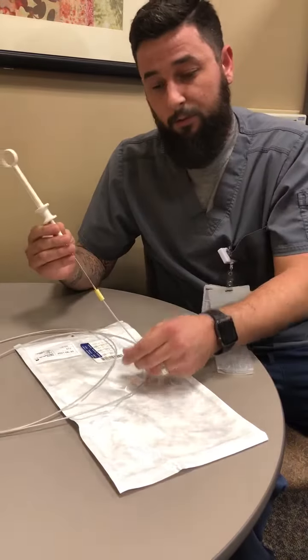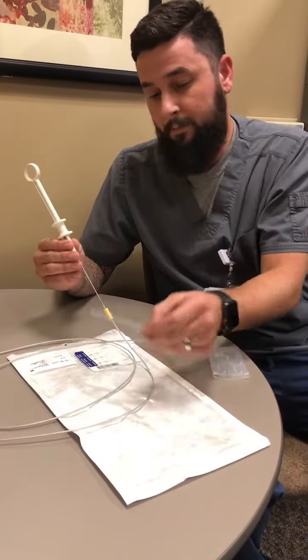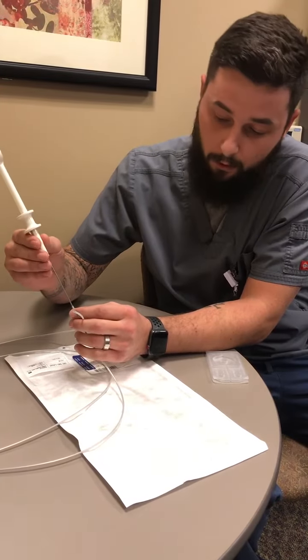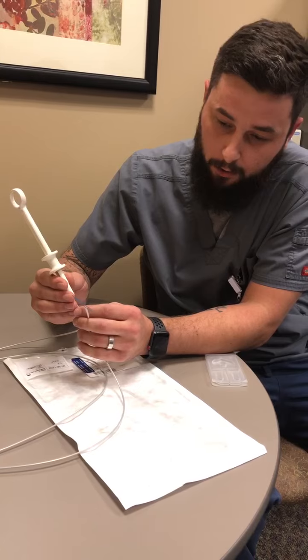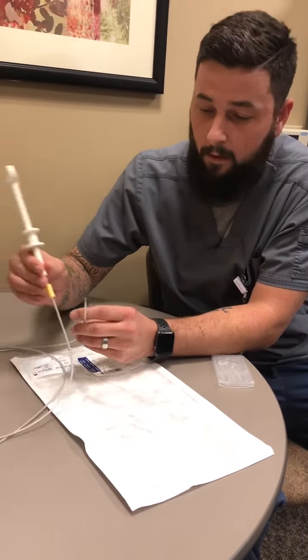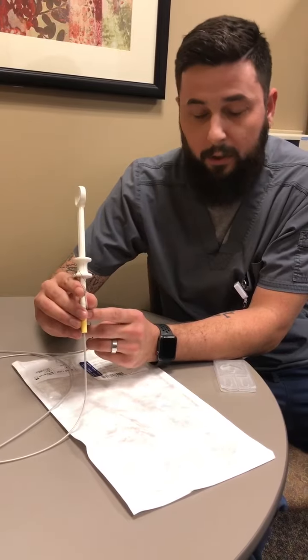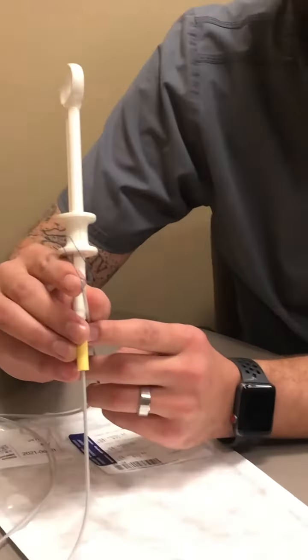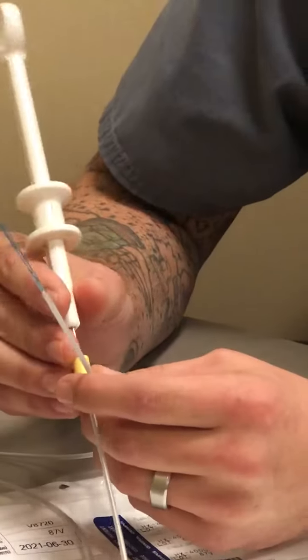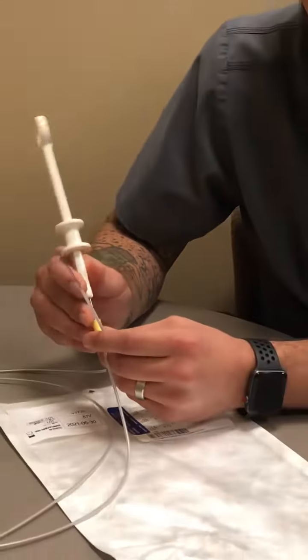Once it gets through the scope, you'll get next to where your polyp is. The doctor will tell you to open. You want to go all the way out, push that yellow stopper back up, and make sure this plastic piece gets all the way out. If the plastic piece does not get all the way out, you won't deploy correctly most times and you'll have to do another poly loop.